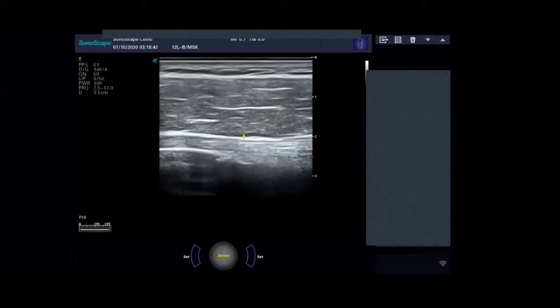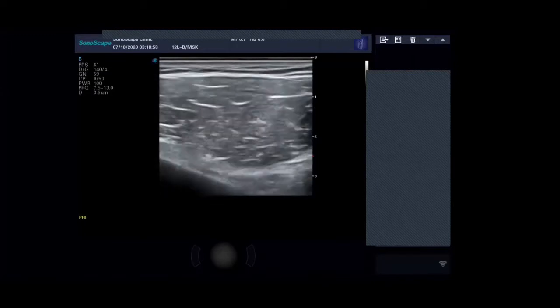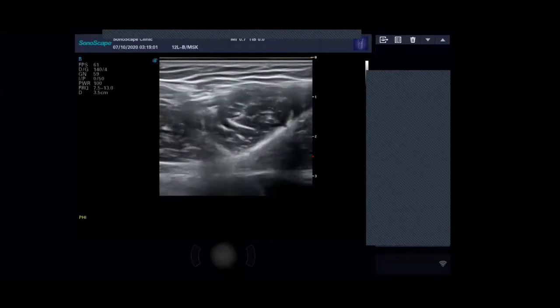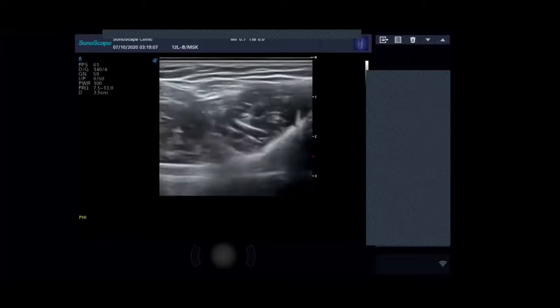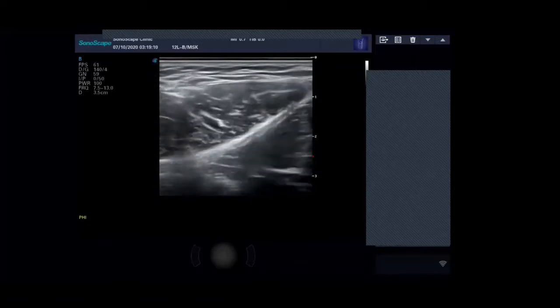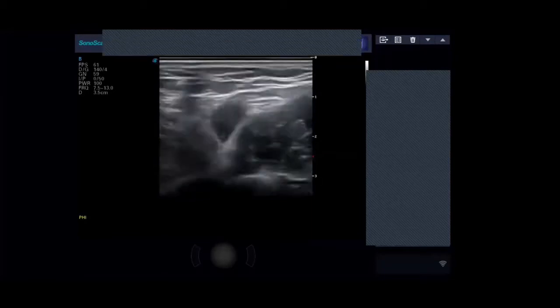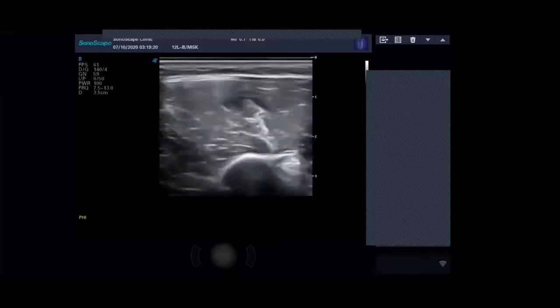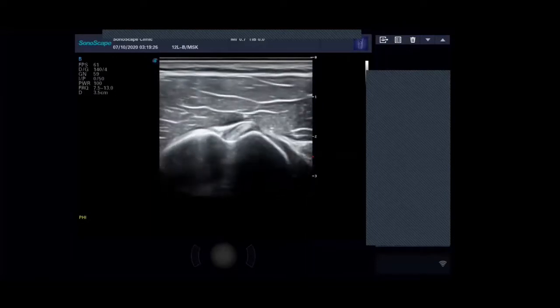Always keep an eye on things exterior to what you're looking at, because you will pick up the odd lipoma or ganglion or cyst or whatever. So just keep your eyes open to what's exterior to what you're looking at. So let's go down a bit more. You follow this down to the muscle-tendon junction here. If you've got a rupture, all this will be full of fluid. For a start, you're not going to see a tendon, and there might be a hematoma down here where it's torn off. But this looks all good. And you can follow that down there, and then back up. And there we go, back up into the groove, and you can see that nicely.